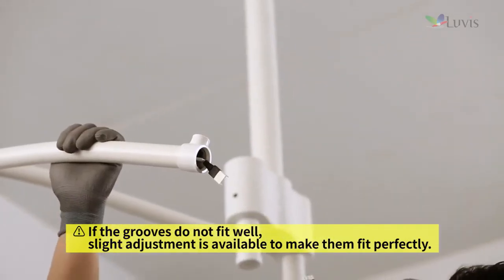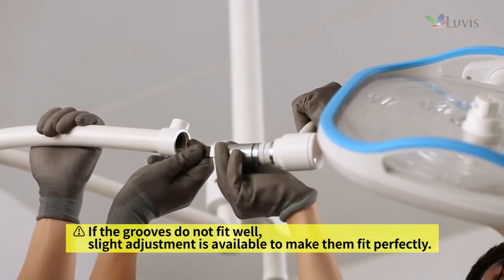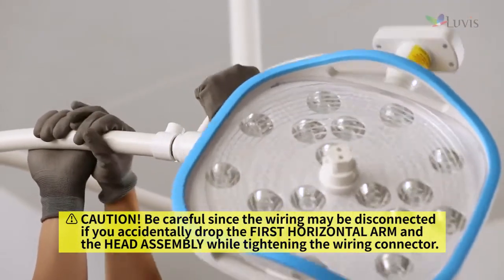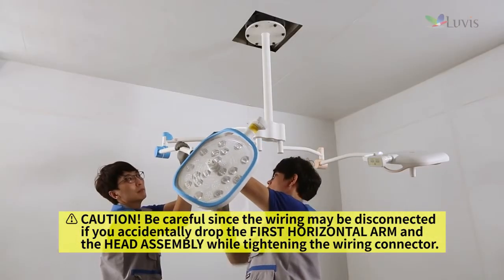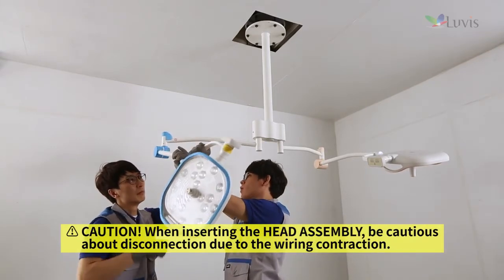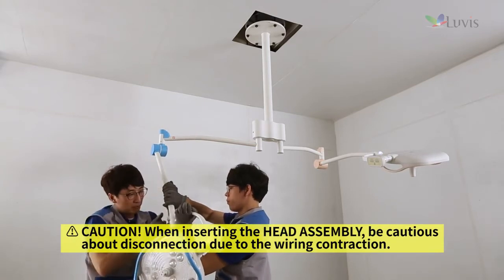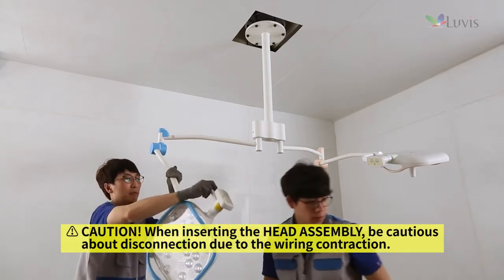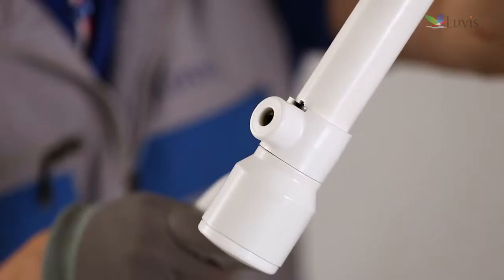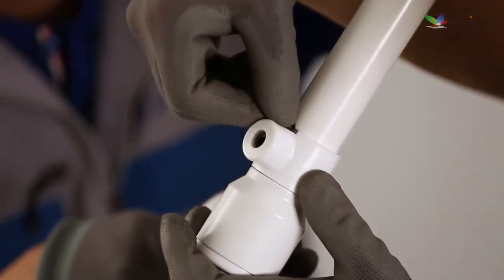Check whether the joint arm groove and the first horizontal arm's head locking key groove fit perfectly. Tighten the wiring connector first to assemble the first horizontal arm and the head assembly. Hold the head with the lighting source facing down and insert the head assembly into the first horizontal arm. Check whether the head assembly is completely installed, then fix the first horizontal arm to the head assembly by inserting the head locking key into the adjusted groove.